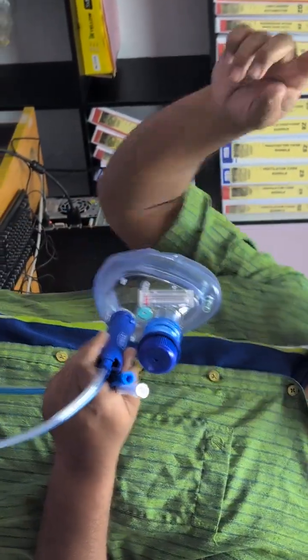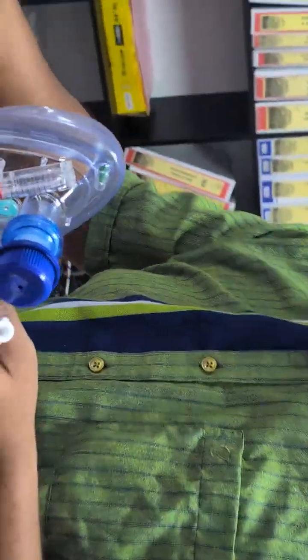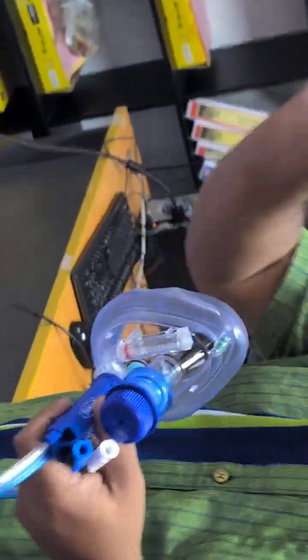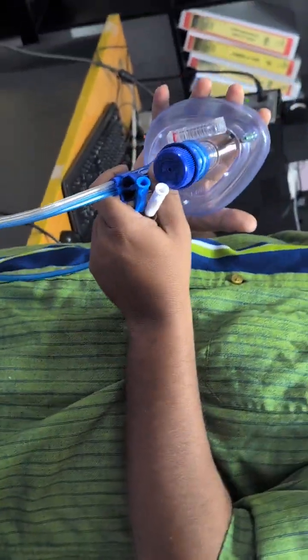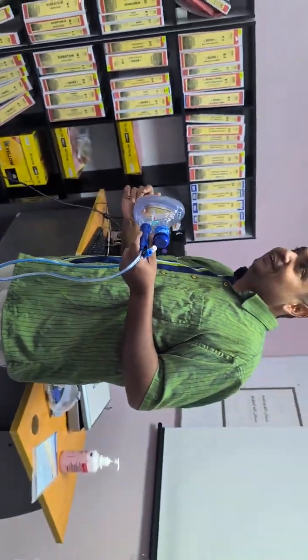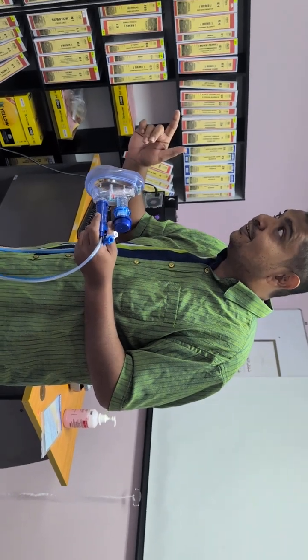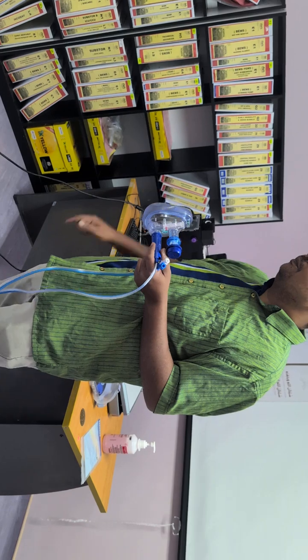The reason why I'm telling you this: I'm talking about pre-hospital care so much because this was initially meant for pre-hospital care. Then what I realized was this, and correct me if I'm wrong, doctors. Let's say you're going to wean off the patient from BPAP to CPAP and send him down to the ward. Do you send the patient down with machines, a BPAP, CPAP machine, or any kind of machine to the ward?